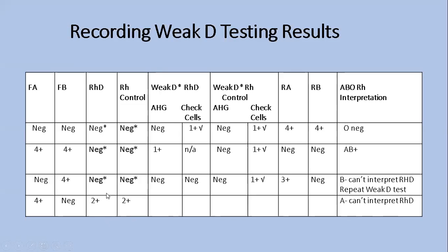In this case, we'd want to repeat, maybe with a different anti-D, maybe a low protein anti-D, and see if everything works out okay. If not, we'd have to move forward and do some additional investigation. So hopefully this all makes sense.